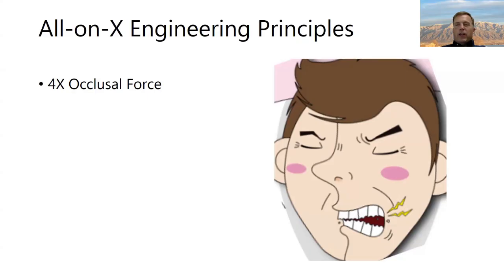If you think about your single tooth restorations, your material selection might be quite different for a number 8 as it would be for a number 2. The reason is obviously because there's much more force on the number 2 case, and a lot of times you don't have the same restorative space.